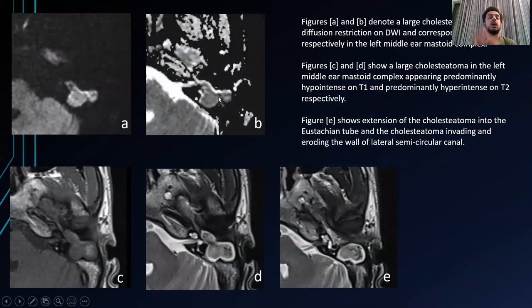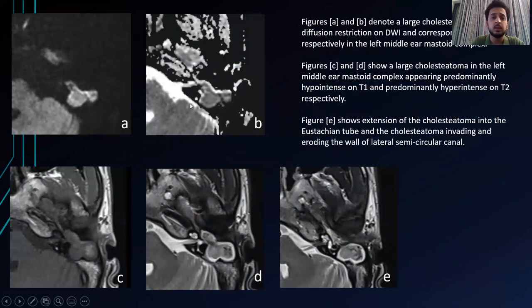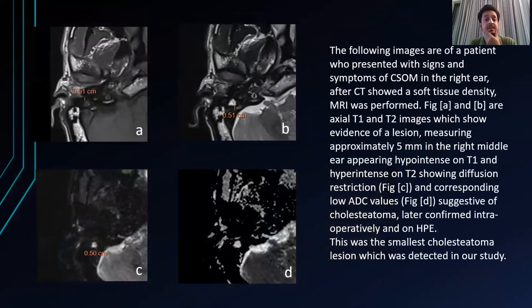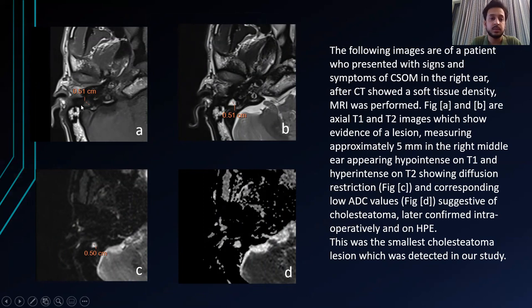Here are some cases. The first case had a large cholesteatoma in the left middle ear, which appeared predominantly hypointense on T1 with a few hyperintense foci, predominantly hyperintense on T2 axial, and showed diffusion restriction with low ADC values. The soft tissue was seen extending into the Eustachian tube. In the second case, there is a soft tissue lesion in the right middle ear on axial images, appearing hyperintense on T1 measuring 5 mm, with corresponding hyperintensity on T2 and showing diffusion restriction and low ADC values. This was the smallest cholesteatoma we detected, at 5 mm.